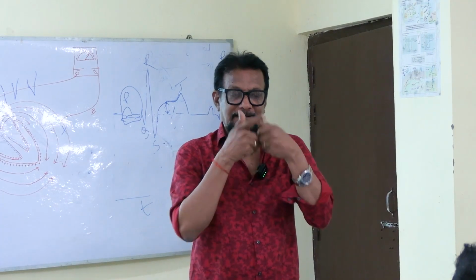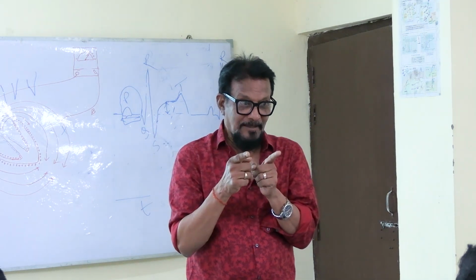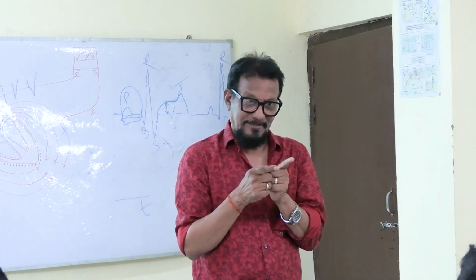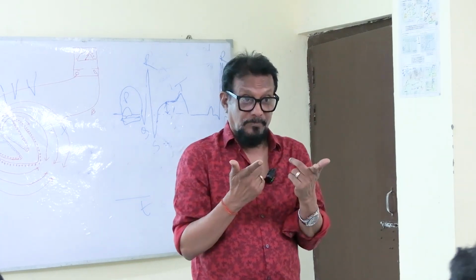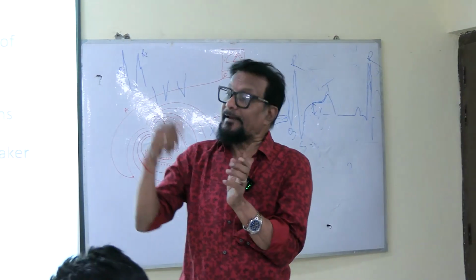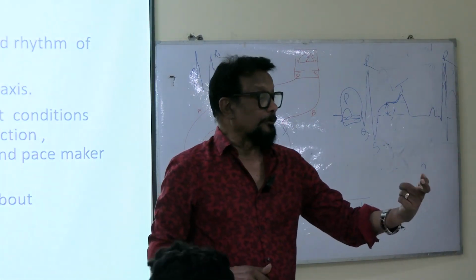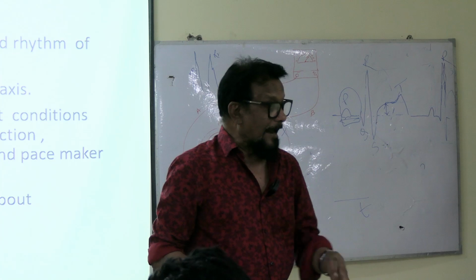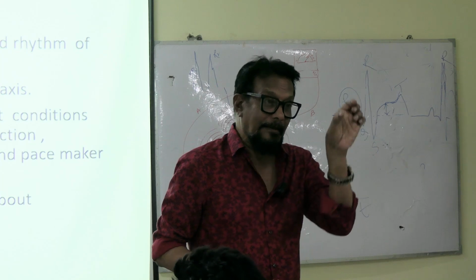When you are inhaling, your heart rate will increase. As a result, the cardiac cycle will be shortened, so the PR segment and PR interval will be shortened. Since the cardiac cycle length is shortened, the heart rate is more. With that you can identify what happens during inspiration. Yes, it is increased. And during expiration, again, the heart rate is reduced.